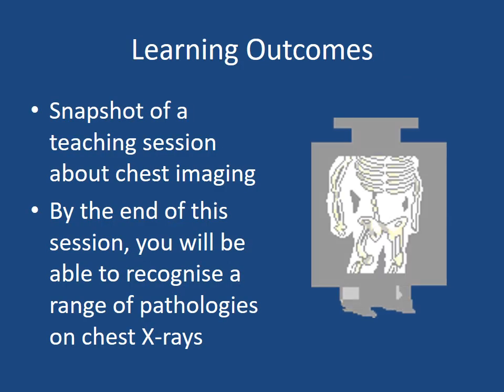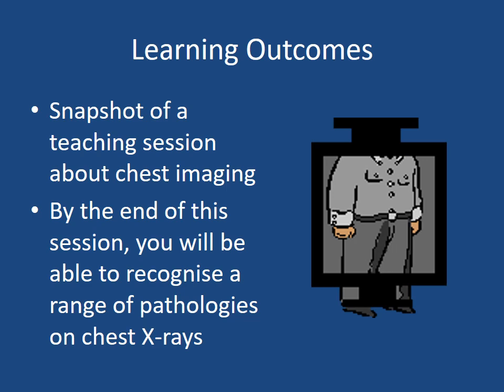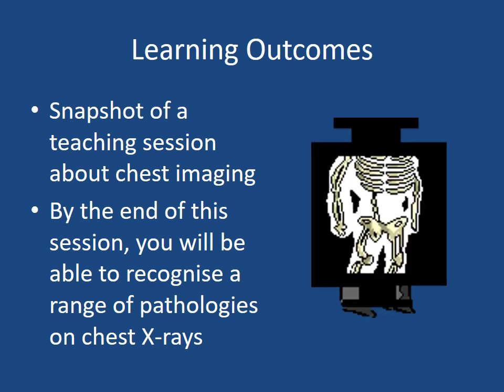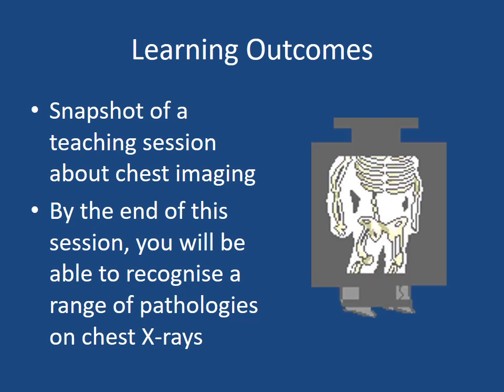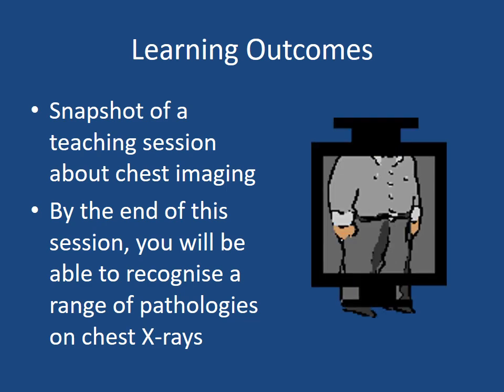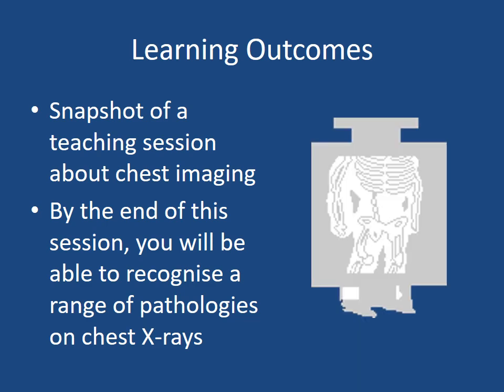So here's what I'm aiming to cover in the session. As I mentioned, this is a snapshot of a teaching session, and it's about chest imaging. There's also a separate file that you can look at that is a quiz. So once you've looked at this narrated PowerPoint presentation, you can then go ahead and take the quiz that's based on it. The outcome by the end of this session is just to enable you to start to be able to recognise a range of some pathologies on chest x-rays.